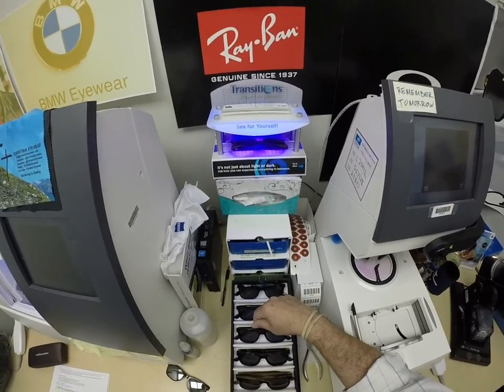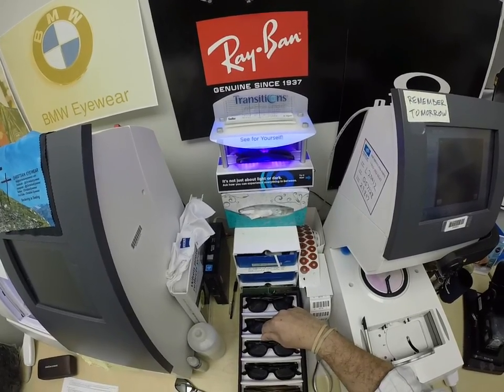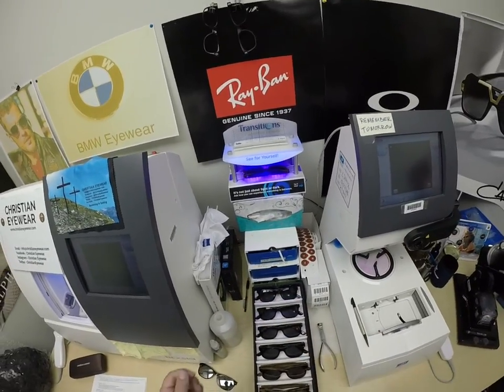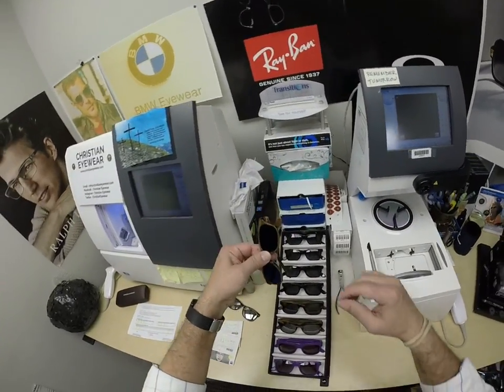Your windshield absorbs the sun's harmful ultraviolet rays — it would cause your dashboard to crack by sitting in the sun all day — and that's why they don't turn dark in a car. If you have a convertible, a motorcycle, a skateboard, or a scooter, they will turn dark.